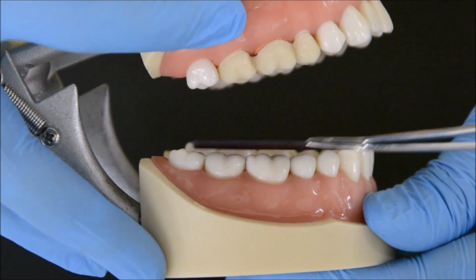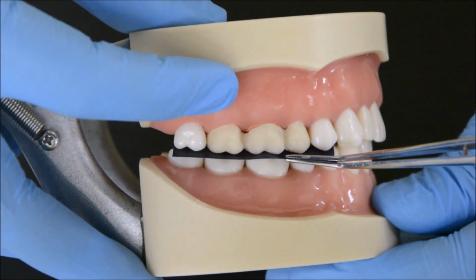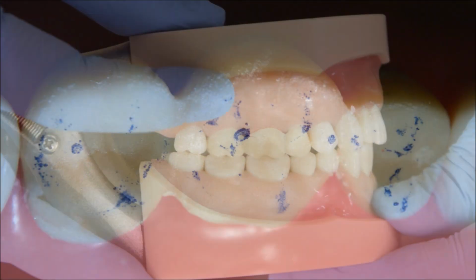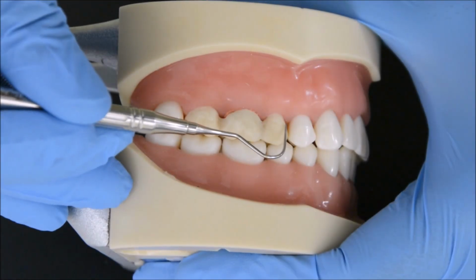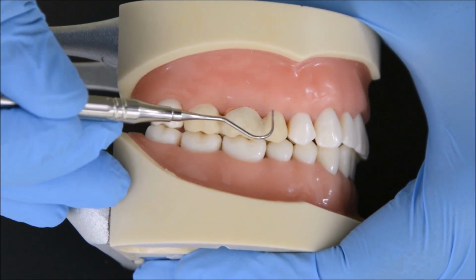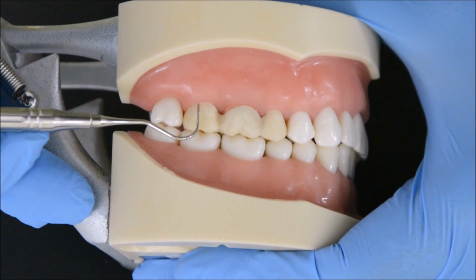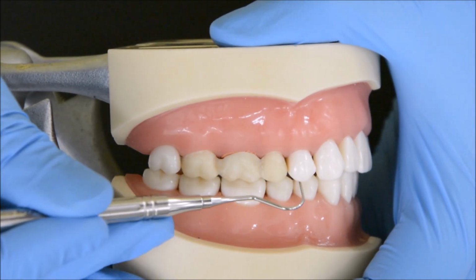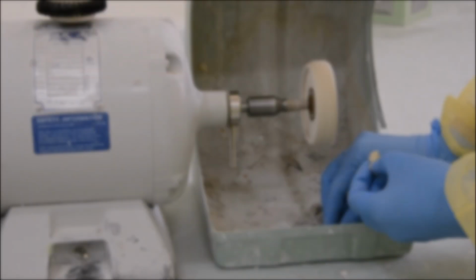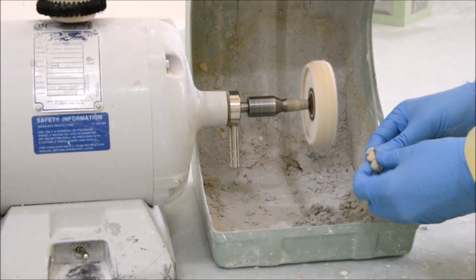Occlusal interferences are checked by using an articulating paper held between the maxillary and mandibular teeth. The teeth are occluded in maximum intercuspation. After removal of the interferences, the prosthesis is occluded. Check for marginal integrity of both the retainers. Check for intact occlusion between the adjacent unprepared teeth. The prosthesis is then finished and polished. This procedure will be covered in detail in a separate tutorial.